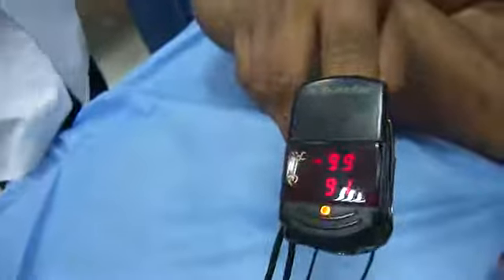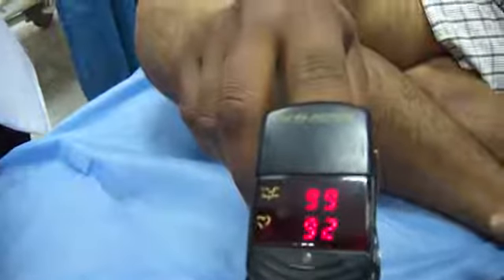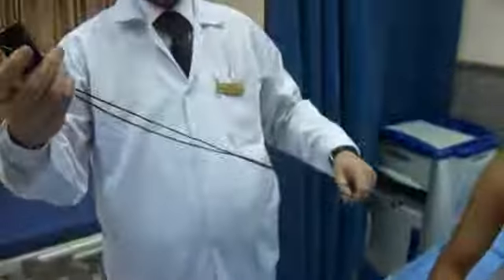Also, it is calculating now. It is also 99, and the pulse rate now is 92. And we have to know that the pulse oximetry can detect hypoxia before the patient becomes cyanosed. And we have many situations in which the pulse oximeter is not accurate.